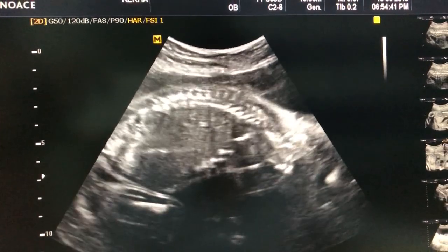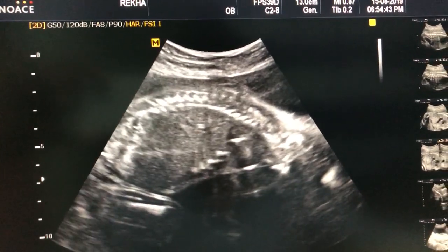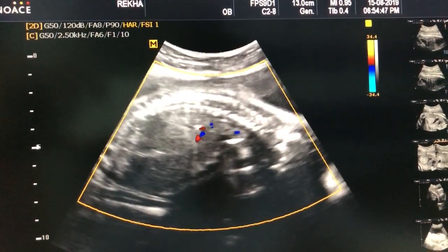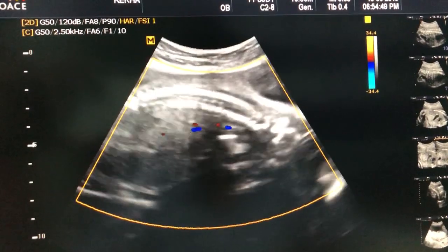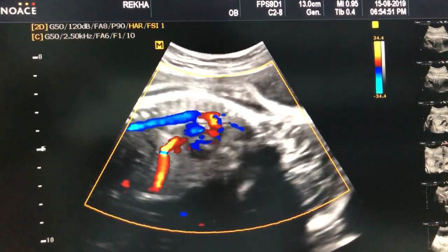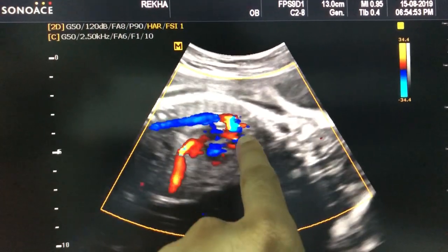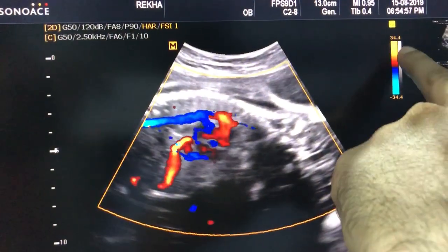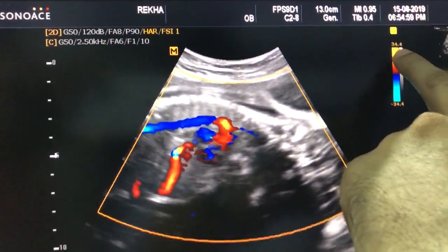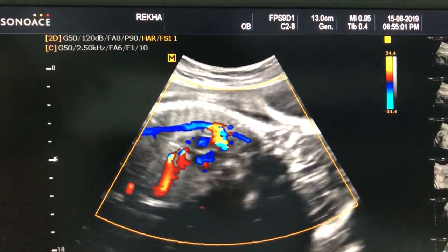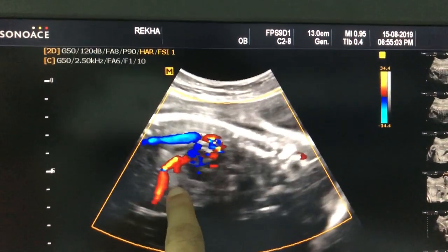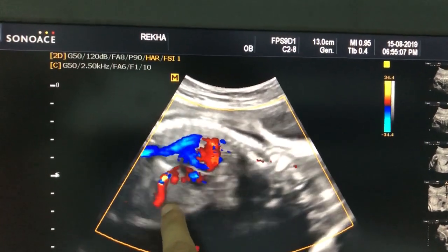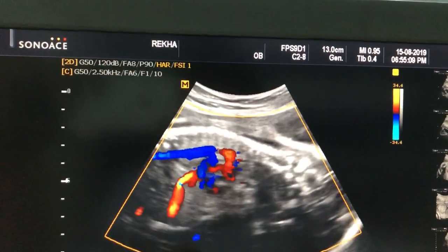This video shows how to catch and identify the ductus venosus. Take this longitudinal view and try to get this aortic arch view. You have to keep the velocity at 34 and then look for the aortic arch and this vessel — you have to get this view.